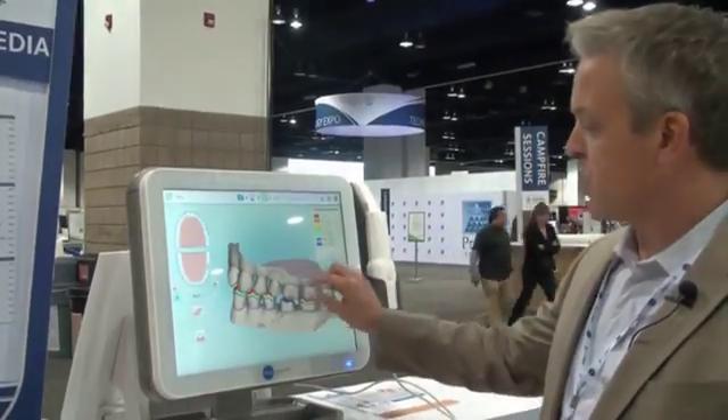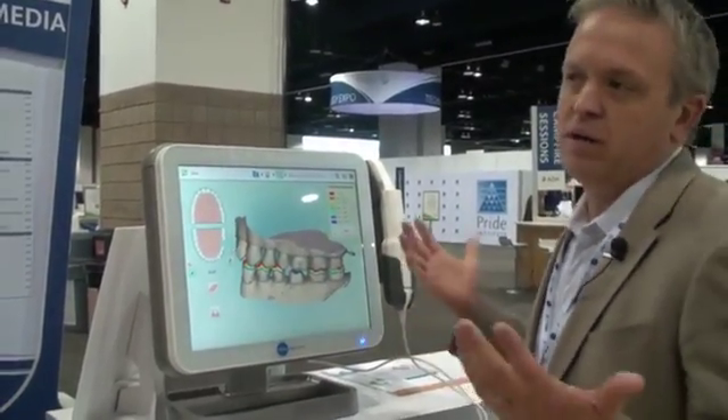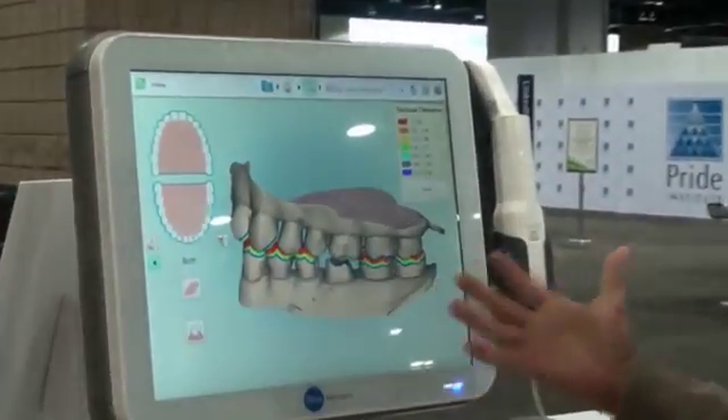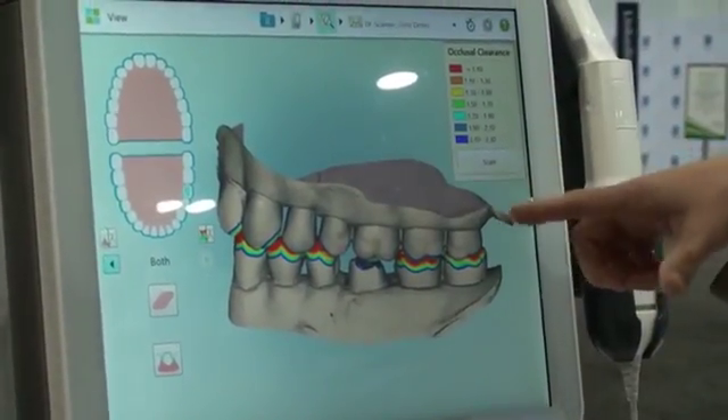This particular scan is for a single crown. It took us about less than 90 seconds to do this scan. A couple of nice features here — a couple of my favorites — we have an occlusal clearance tool.